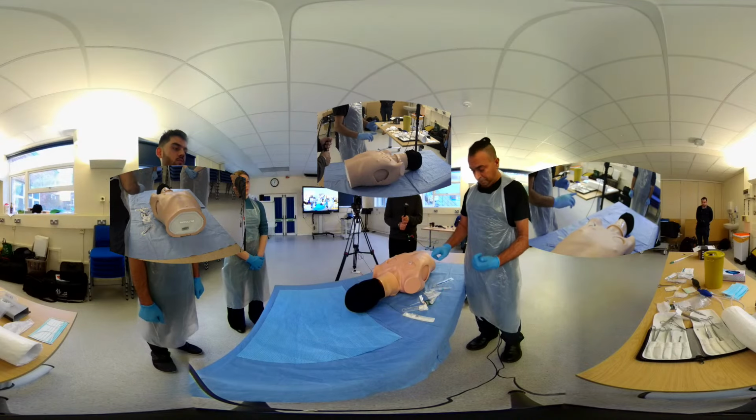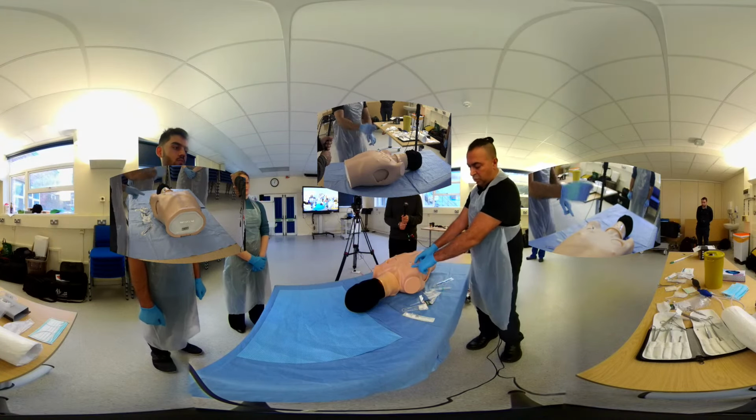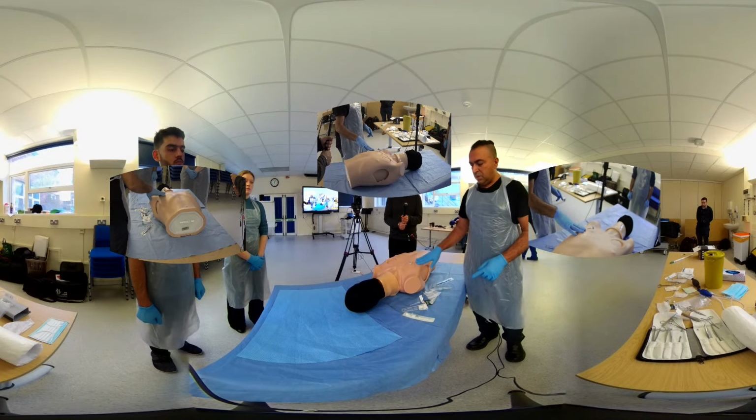So if that happens, don't panic, don't worry. I would leave that one in and do another one rapidly. So you know where to go. I just go a little bit more lateral, bang, put another one in, but then you really don't have much more time. So then you really rapidly need to progress onto your chest drain, but that's how to do the needle.